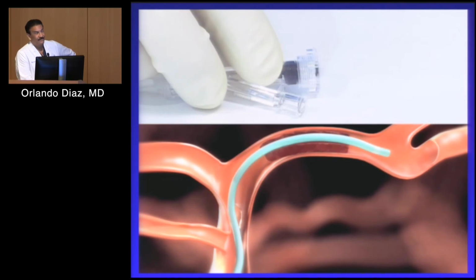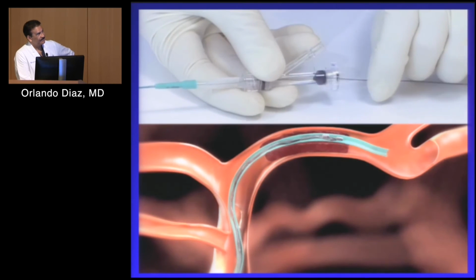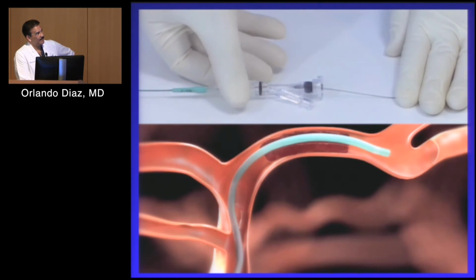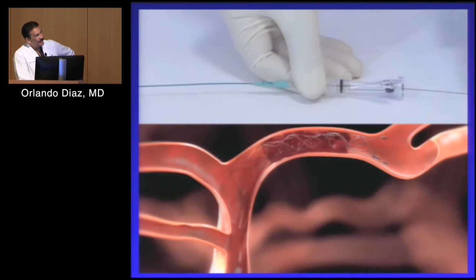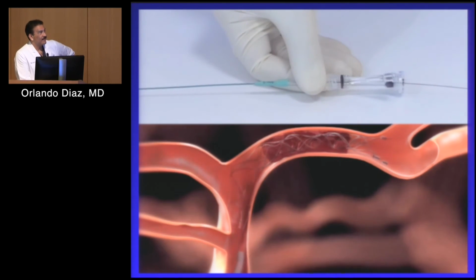Take the wire out. Go with the clot retriever. Hold the wire and unsheath. So this is opening. Then when it's opening, we wait 5 minutes. Immediately we have flow, because this is opening a lumen. So still it's getting oxygen to the brain. Then we wait 5 minutes, 3 minutes, just to get this well expanded, but it's already there.